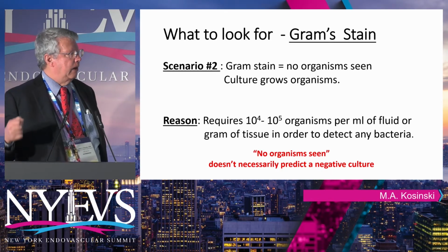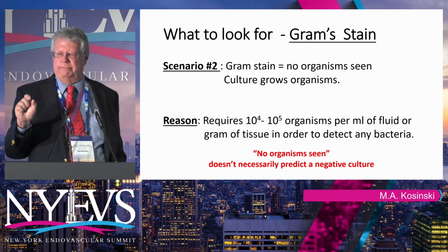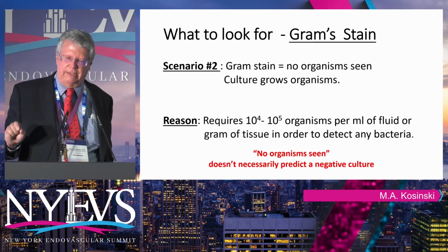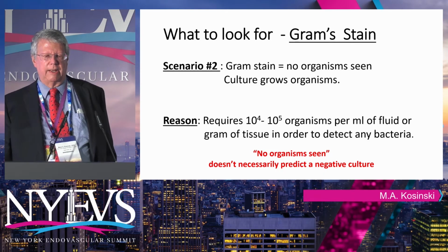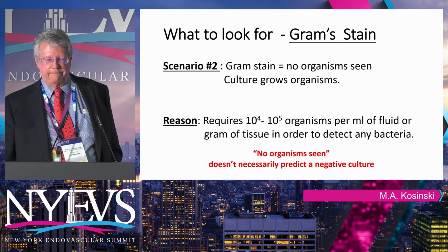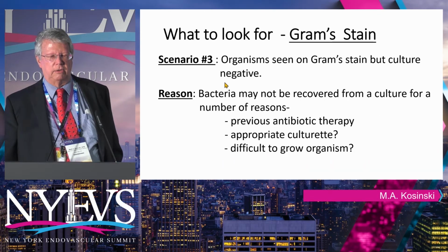any bacteria. And when we deal with the foot, when we deal with toes, little tiny abscesses, maybe touching the tip of that cotton-tipped applicator to that barely perceptible exudate, we're not giving enough of a load to be able to see the organisms on Gram stain, and yet it's enough to grow when that bacteria is in culture. So no organism seen doesn't necessarily predict a negative culture.